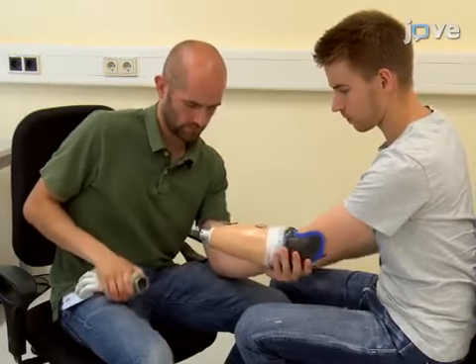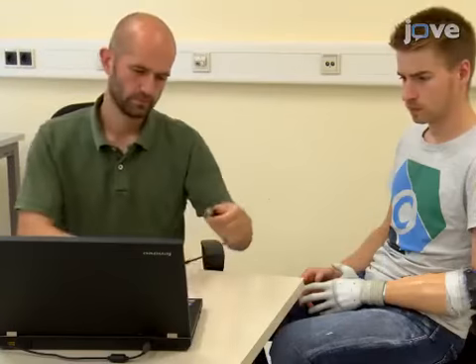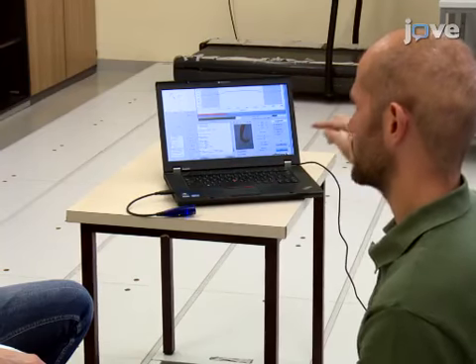Begin by fitting a customized socket and prosthesis to the participant. Calibrate the prosthetic hardware and use the collected calibration data for real-time prosthetic control. Do not give the participant any formal training.